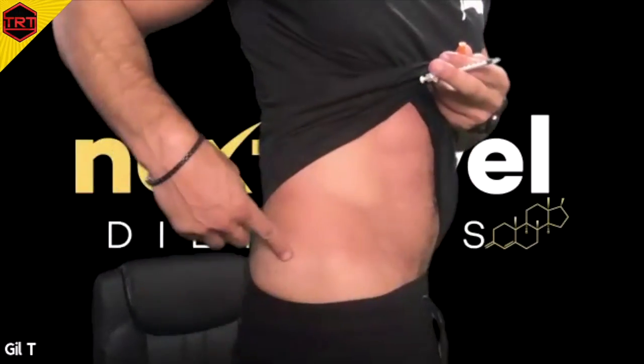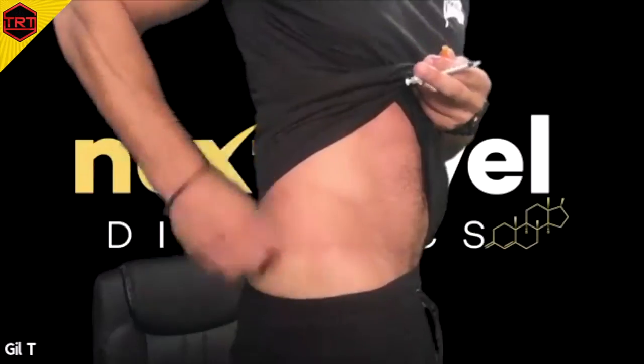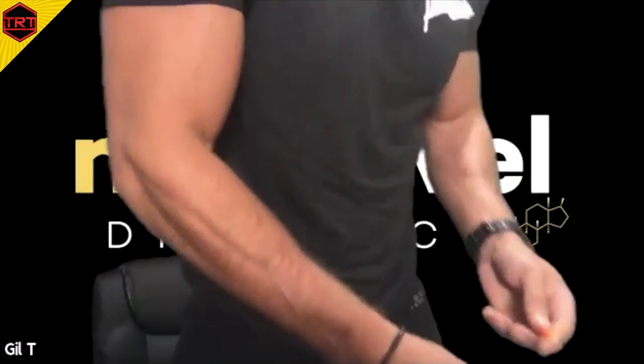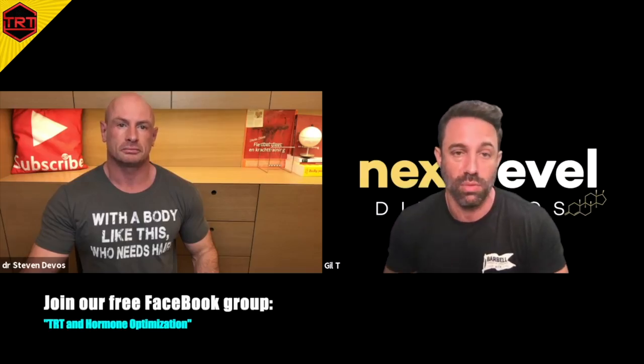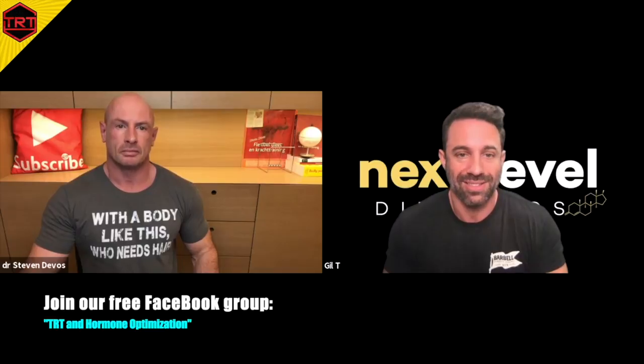And done. As you can see, really nothing there. Give it a little wipe and we're finished. I don't have a sharps container here, so I'm just going to recap this by putting the cap on the desk and pushing down into it. You never want to recap a needle with your hands because if you slip — especially if you're injecting someone else like we do in the clinic — you run a risk of infection. So essentially, never recap a needle, just discard in the sharps container. That is literally as easy and simple as a ventrogluteal injection is — completely pain-free, and usually there's no blood whatsoever.